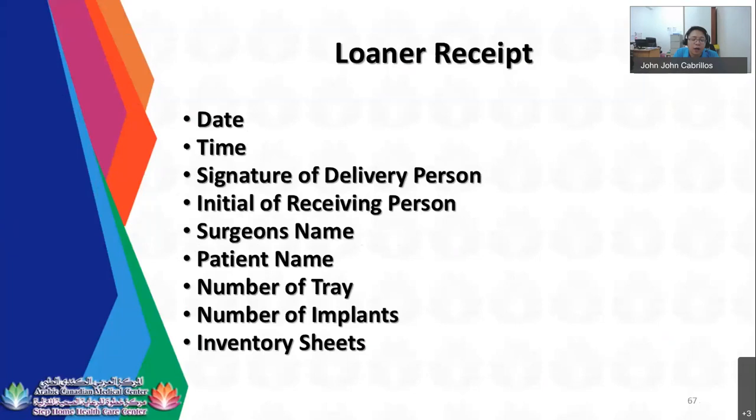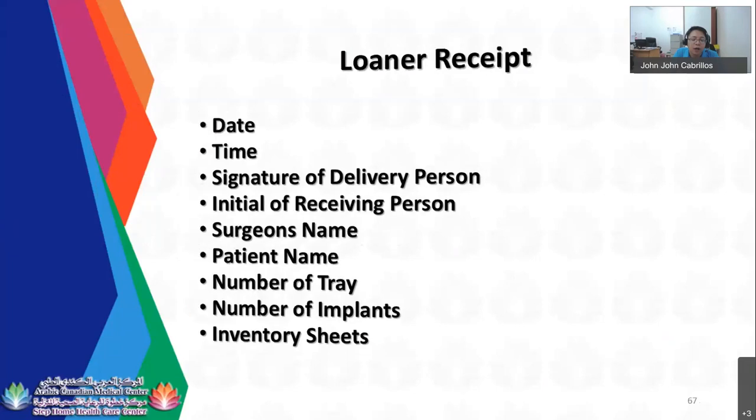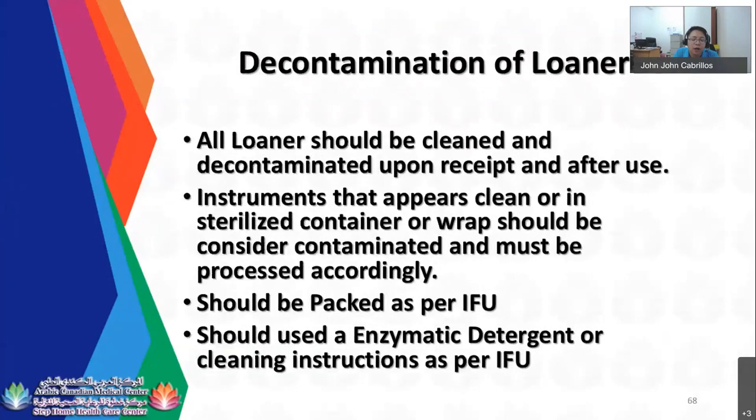So you need to inform them if there are lacking instruments from your inventory list, unless you want to pay them. Because for any loss of any instruments, you need to pay them. So for decontamination of loaners, all loaners should be cleaned and decontaminated upon receipt and after use. Instruments that appear clean or are in a sterilized container or wrap should be considered contaminated and must be processed accordingly. They should be packed as per IFU, and you should use enzymatic detergent or cleaning instructions as per IFU.